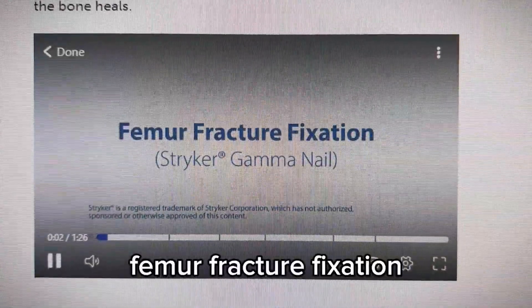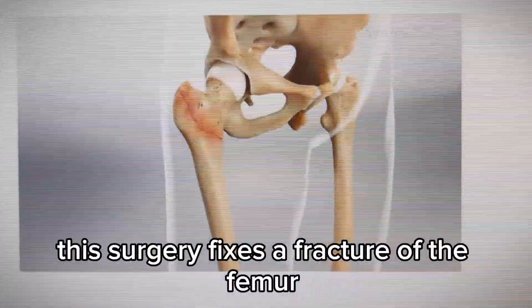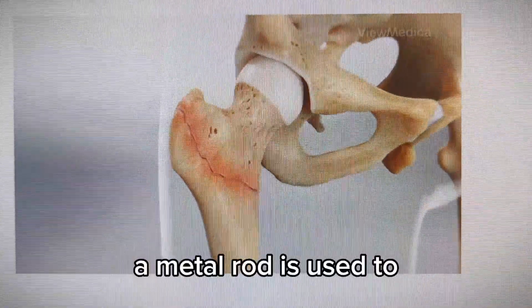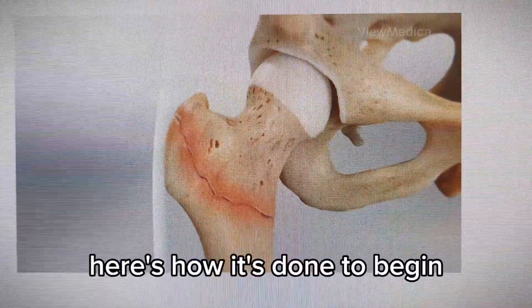Femur Fracture Fixation. This surgery fixes a fracture of the femur. A metal rod is used to stabilize the large bone of the leg. Here's how it's done.